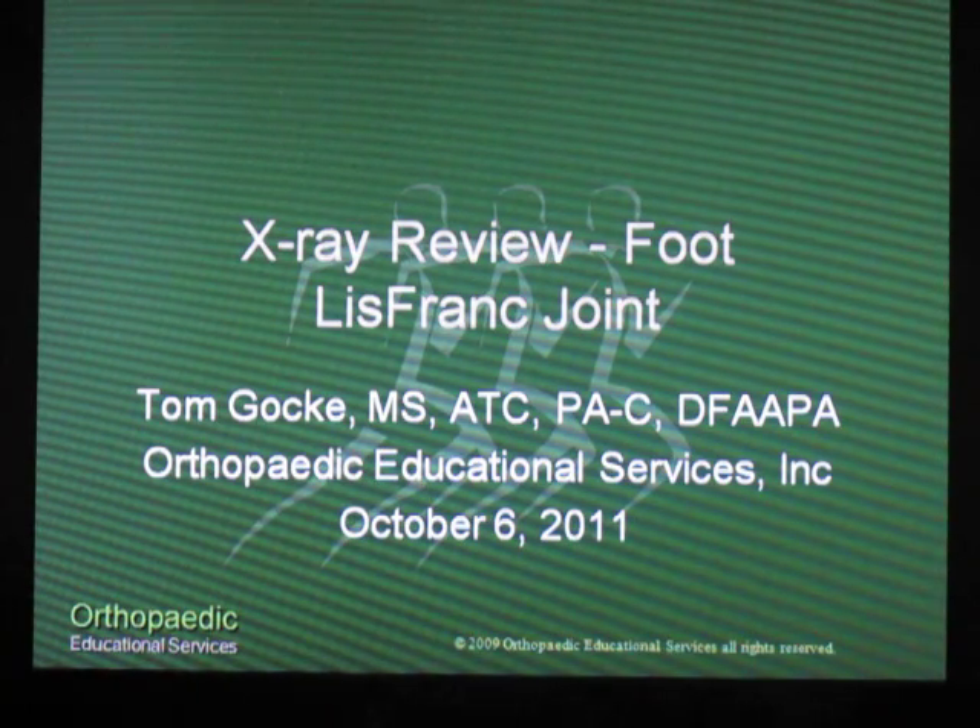This is Tom Gokey with Orthopedic Educational Services. Today we're going to do an x-ray review of the foot and specifically look at the Lisfranc joint.